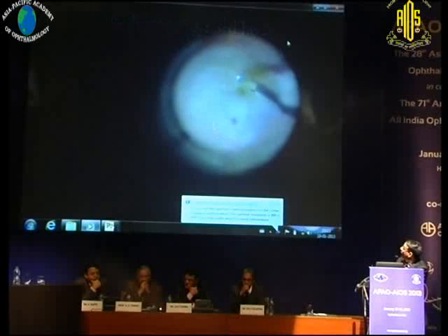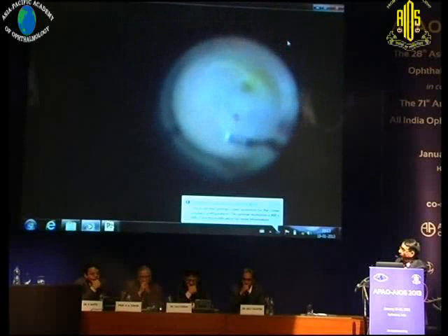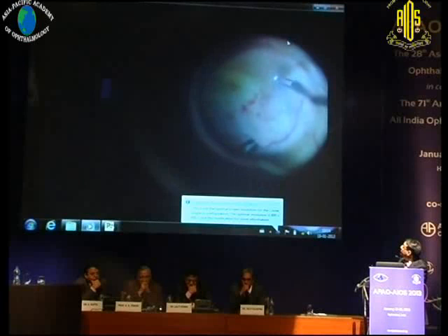You can see very clearly the internal limiting membrane now coming off, leaving these typical punctate hemorrhages on the surface, which is typical of when you're peeling the ILM.